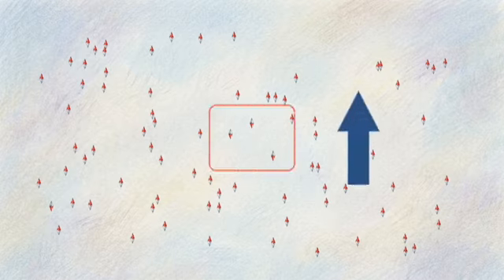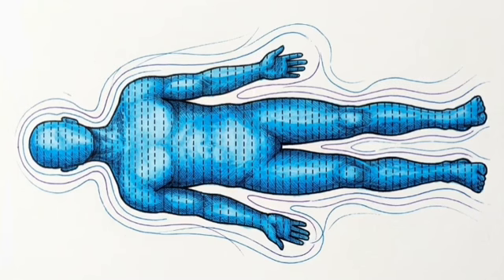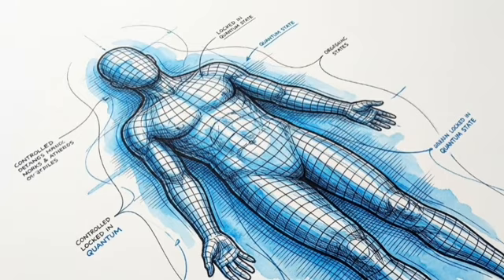The sheer power of this primary magnet immediately overpowers the random orientations of the hydrogen protons inside the patient. It forces millions of these microscopic magnets to snap into strict alignment along a single axis. A very small fraction of these protons will actually point in the opposite direction, like walking on their hands instead of their feet, but the vast majority align exactly with the machine's magnetic field, creating a strong net magnetization. This physical reaction establishes a critical baseline. By forcing the hydrogen inside your body into a unified magnetic state, the MRI creates a blank quantum canvas that it can now actively control.